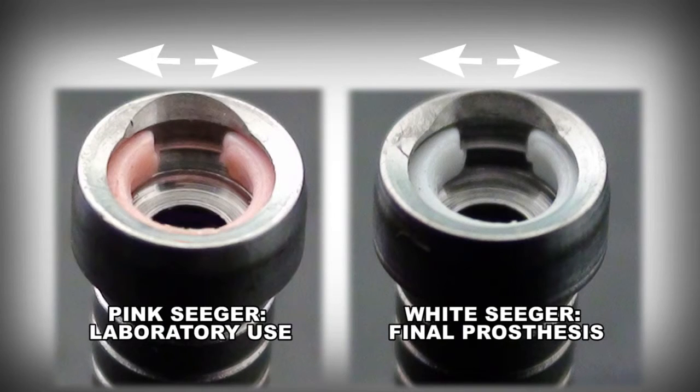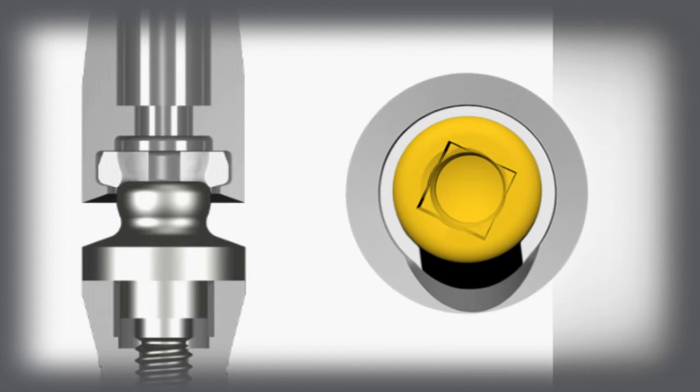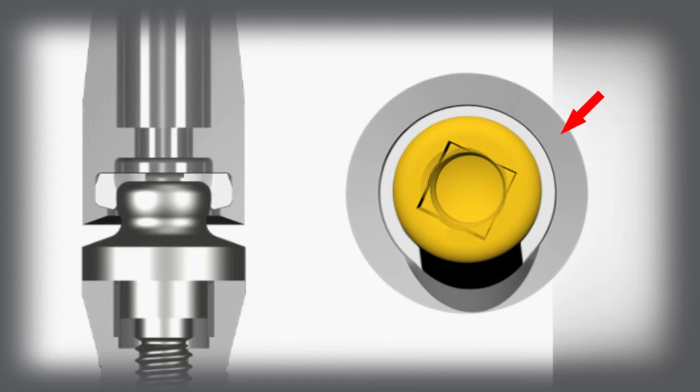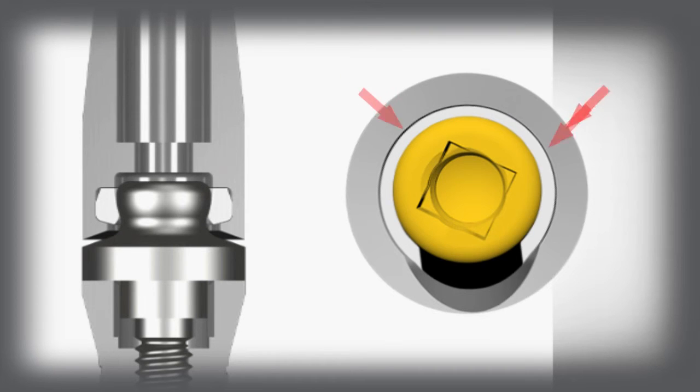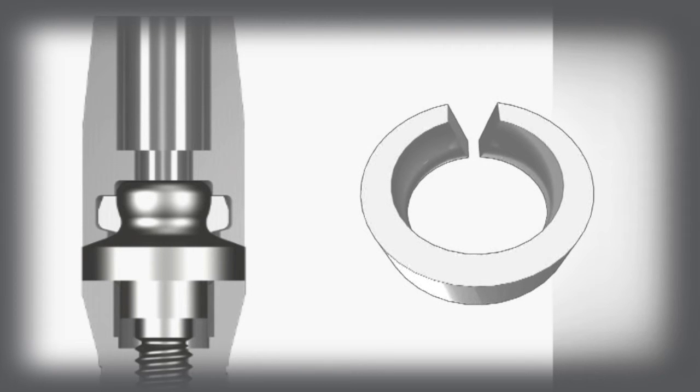The Seegers, thanks to this push, widen at the tip and snap the bridge in place over the divergence of the attachments. As the Seegers are slightly elastic, they tend to squeeze slightly in other parts of the perimeter, if need be, until the bridge clicks into place. The elastic memory allows the Seegers to resume their shape in a short time and complete the seal.